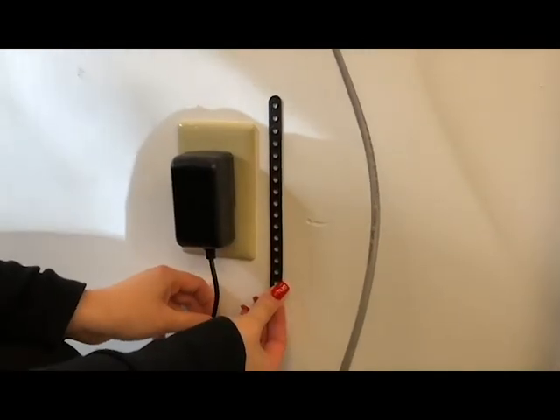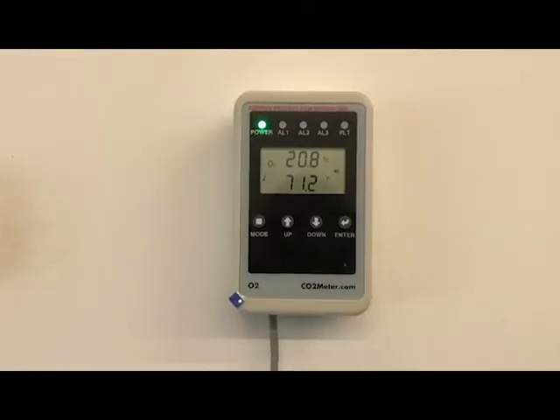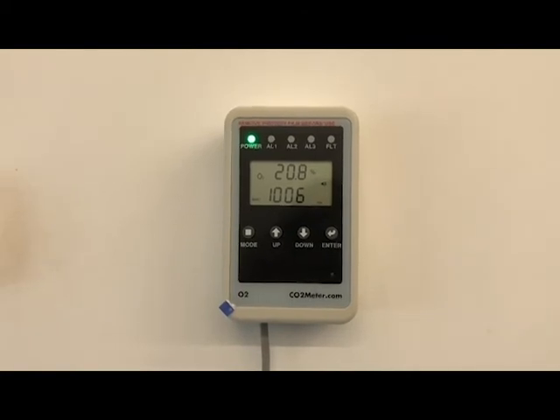And finally, if required, attach the wall plug safety strap. Now breathe easy, knowing you have successfully installed your remote oxygen depletion safety alarm.